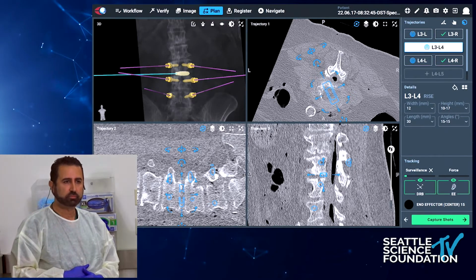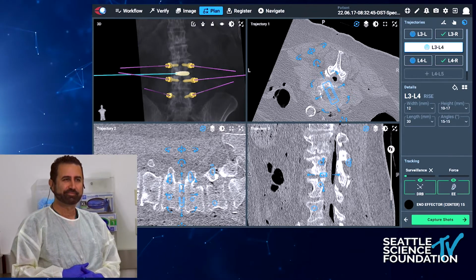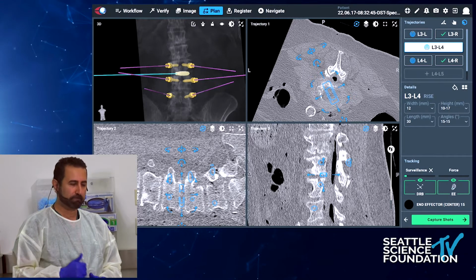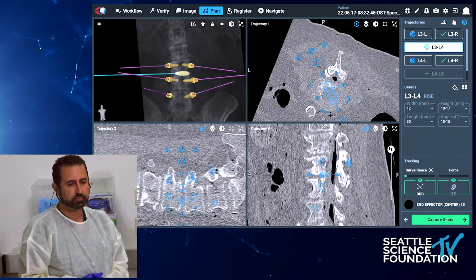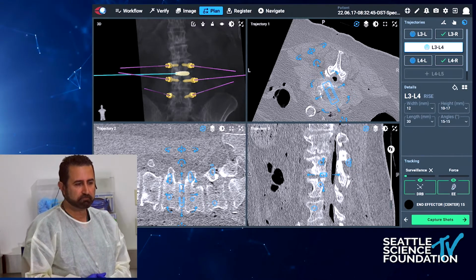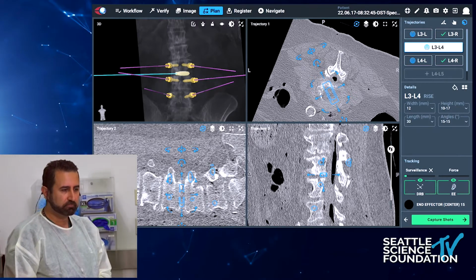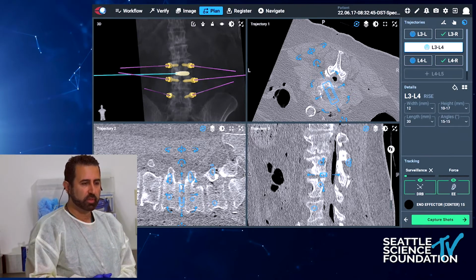Which is great, and we'll have to discuss more later during your lecture, which we anticipated. It was nice to see this live, and again, thank you for taking the time to come here and show us how to do this and how to do it right. And just want to point out one quick question, maybe you can answer that. So you have less radiation for yourself and the OR team. For the patient, this means that we have to have a fine-cut CT scan despite dose reduction protocols. This is at least a 2 millimeter, but usually less than 2 millimeter protocol with cut density. So is this an increased radiation burden for the patient?